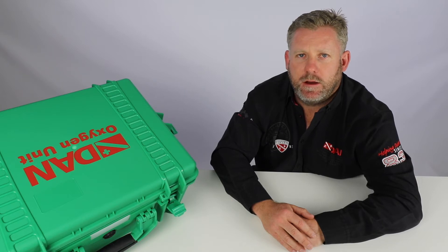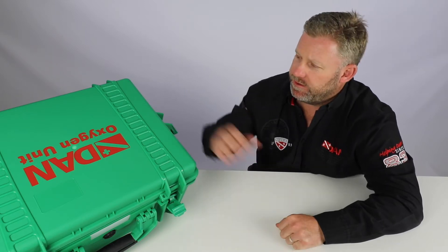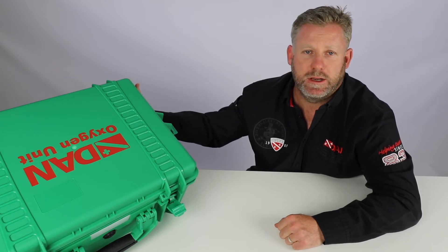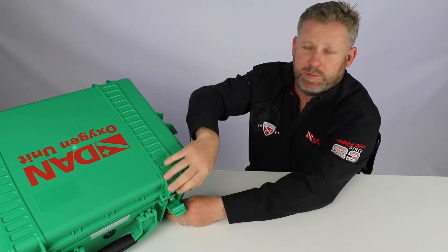Hi DAN members and divers. You're with me, Kevin, your scuba professional. Today we're going to be reviewing the DAN oxygen kit. The first thing we can see about this unit is that it comes in a really robust flight case, ideal to be put on any boat. So let's open it up and see what's inside.